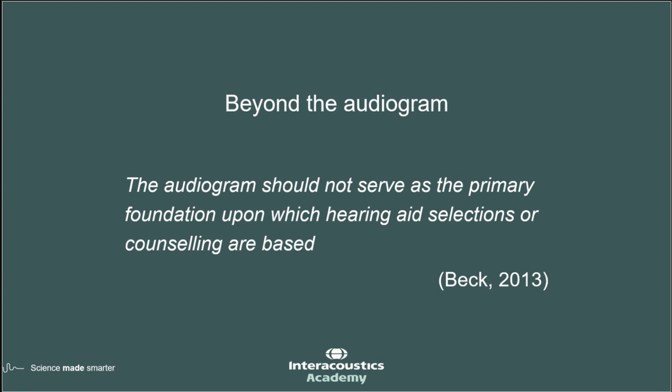I think this quote from Beck that came about in 2013 is really quite a nice highlight as to why we should be going beyond the audiogram. We need to remember it shouldn't serve as the primary and certainly not the only foundation that we use to make decisions about hearing aids, hearing aid features, how we counsel. There's so much more that we need to be bearing in mind.